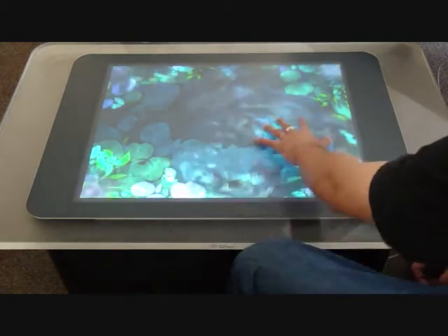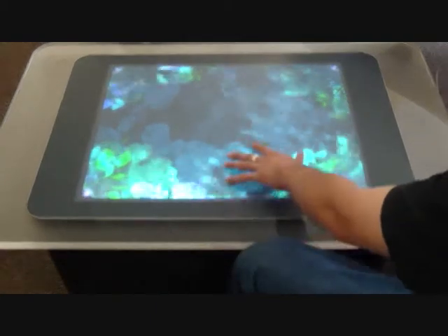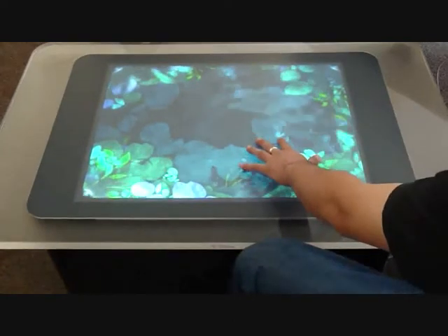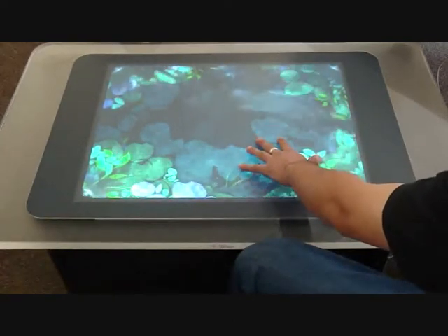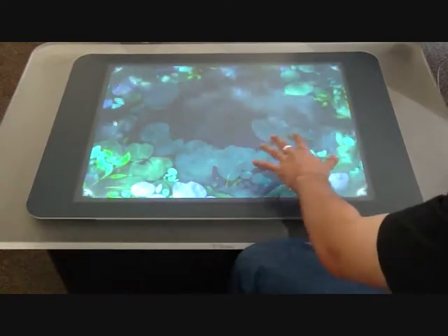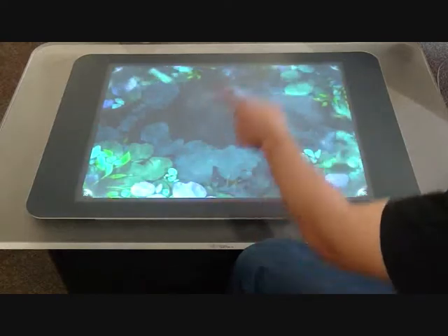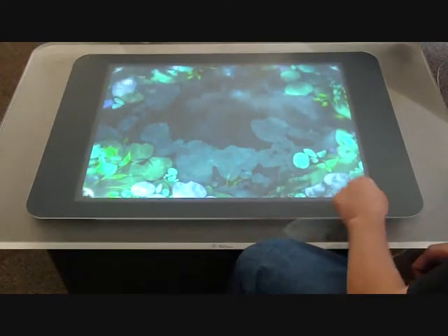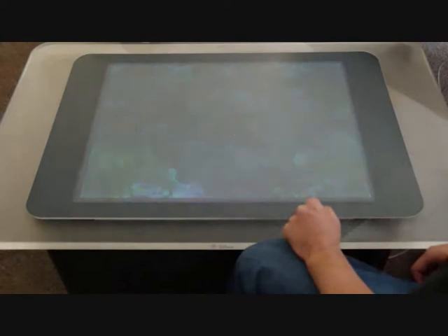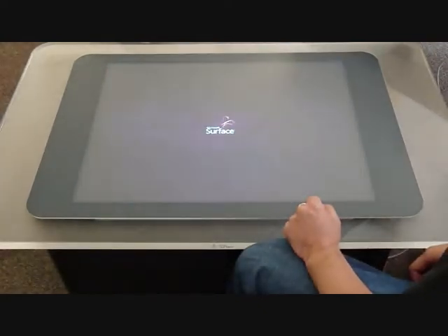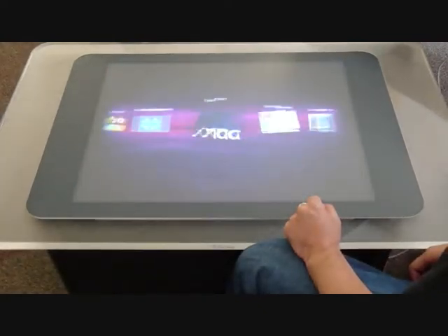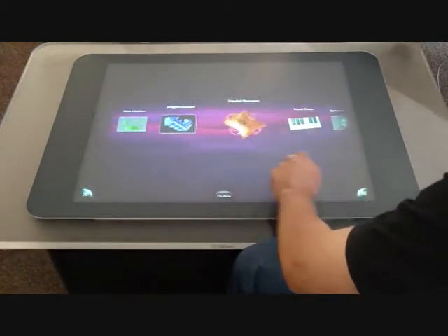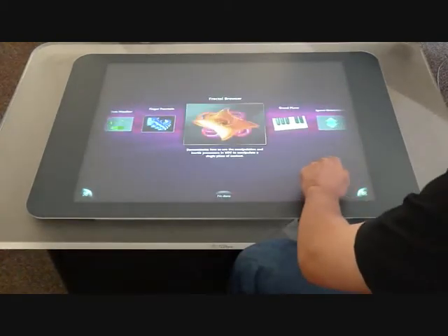As you can see, this is the main attractive application of the Surface table. When you touch it, it recognizes your finger and generates some water waves. At the four corners, you can see there are four buttons. If you click one, it guides you through the list of applications stored on this machine.